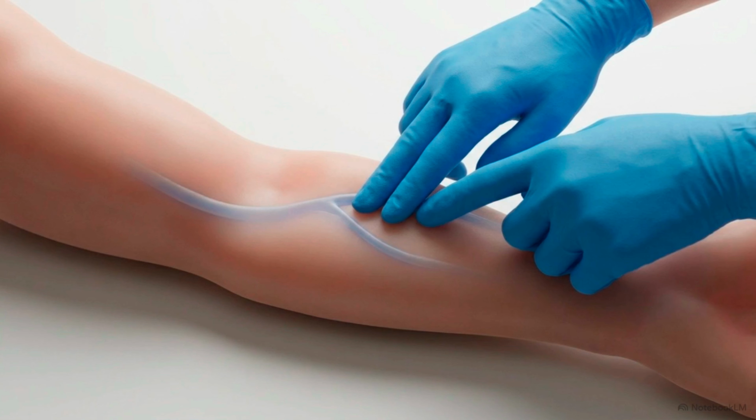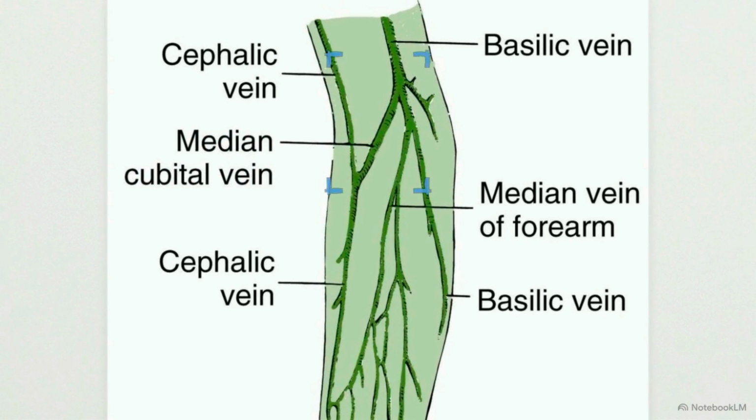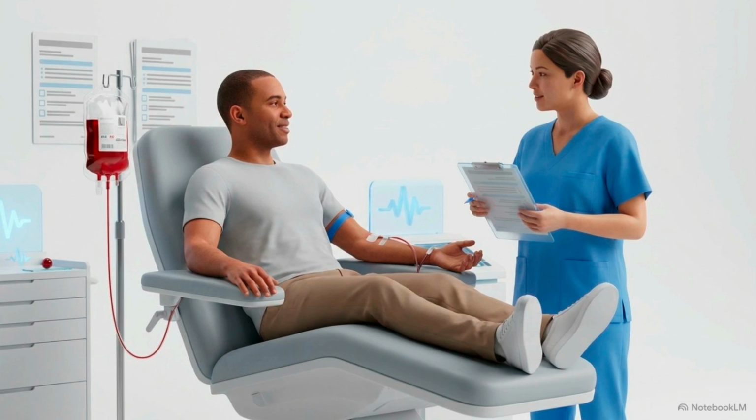With the vitals recorded, visually inspect the antecubital fossa on both arms. As seen here, you're looking for a suitable target like a median cubital vein, while simultaneously checking for skin lesions or track marks that indicate illicit intravenous drug use. When a healthy donor passes these physiological thresholds, you can be confident the collection process will not induce shock or cause them physiological harm.